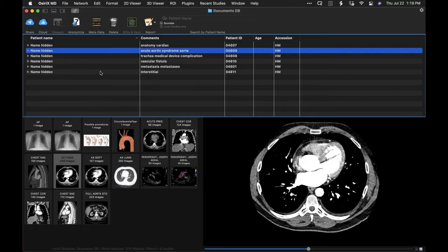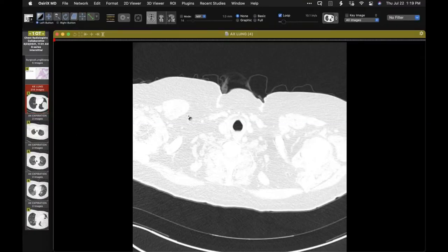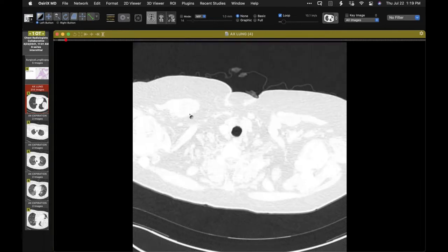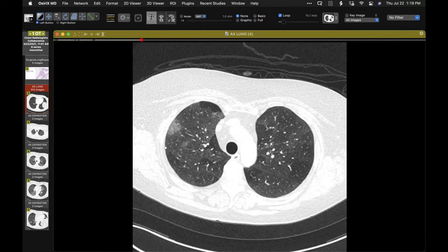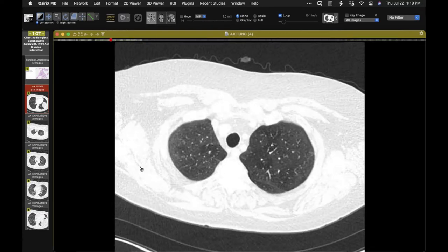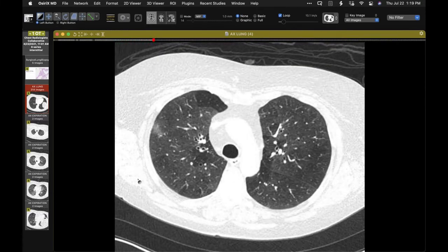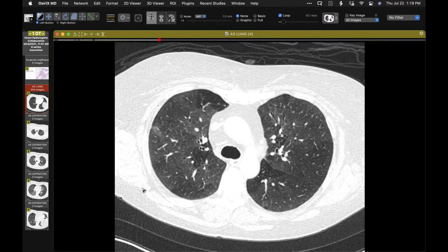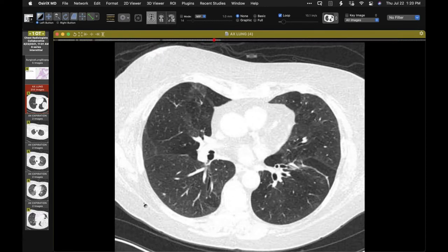Let me show you. This one is nice from the point of view of imaging, and then I'll show you just because I do have them annotated slides. Now, in this particular person, I did not personally report this CT in this patient. So let me scroll through it for you for an ILD case. So here is what the lungs look like. You begin to see mosaic attenuation pattern. I will show you a couple of expiration images in a moment.